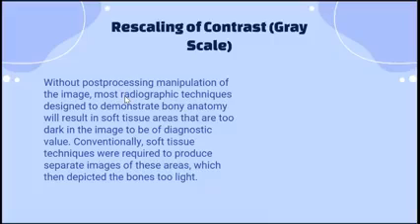So if it's bony detail, we have to sacrifice the soft tissue because bony detail is what the doctor requires. Okay? So for instance, the patient had an accident and acquired a fracture. So what do we focus on? Is it the bone or the soft tissue? Of course, we will focus on the bone. Okay?